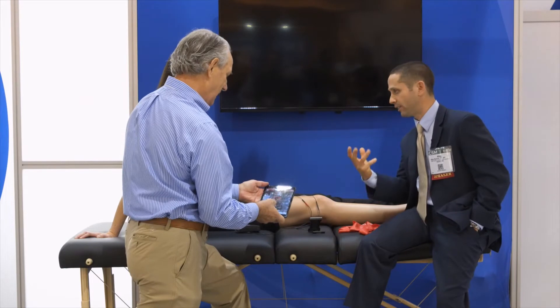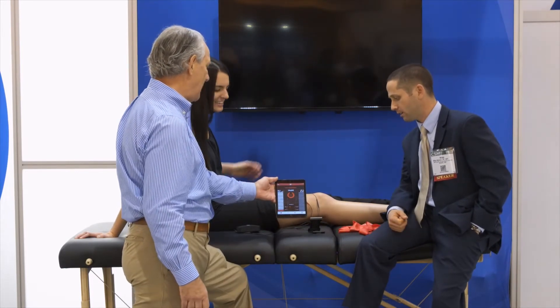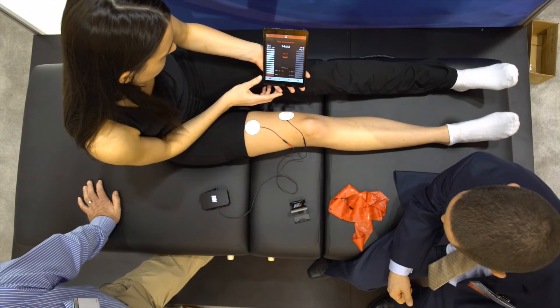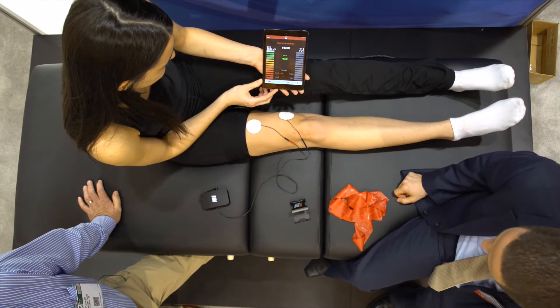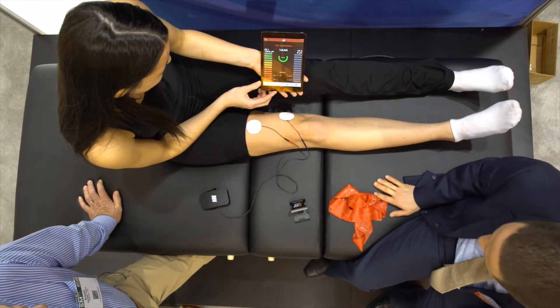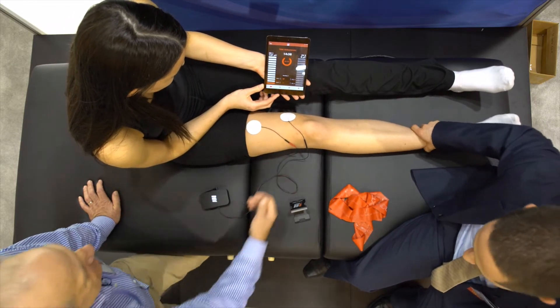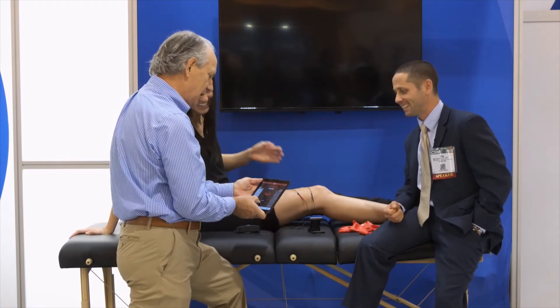She can see the color and if it's yellow you say squeeze more. You hit the play button here and it says relax, just hold it there for a bit. Then it'll say flex and she'll flex — squeeze hard now, force the back of your knee straight and keep that light full. It helps with quad re-education and in this case it helps with extension also. No doubt she just had 20 degrees of extension improvement.